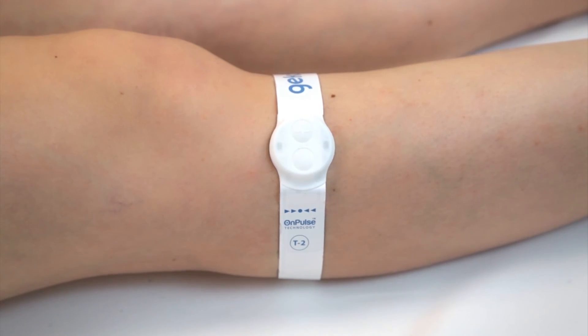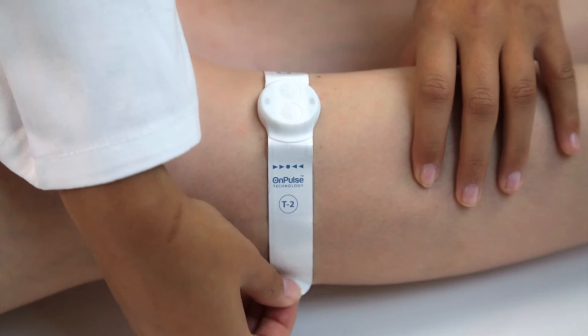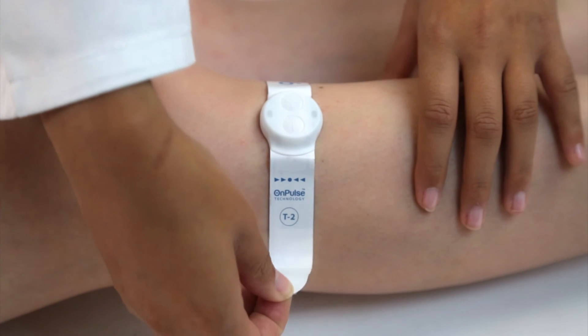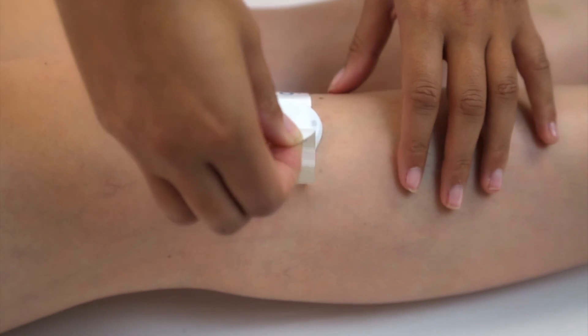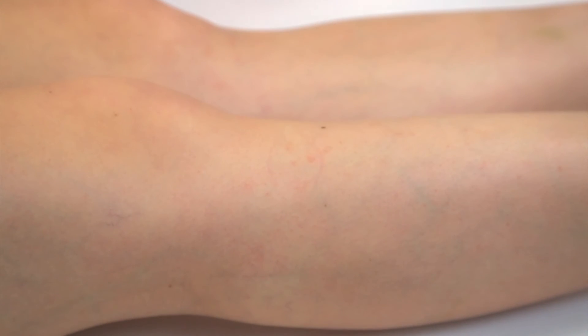To remove the GECKO, gently lift the long end of the device, taking care to peel the adhesive gel off the skin along with the device. Lift it away from the leg progressively without bending it double. This will preserve the device and prevent damage to the skin.